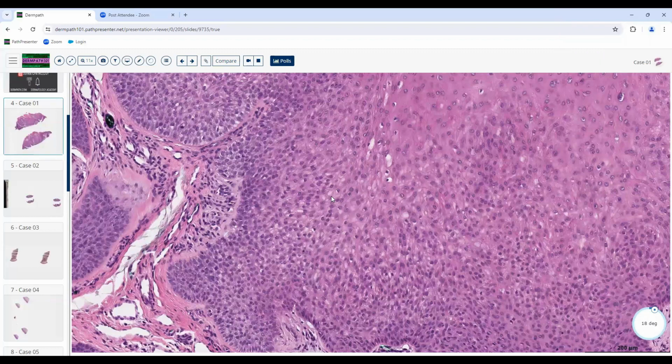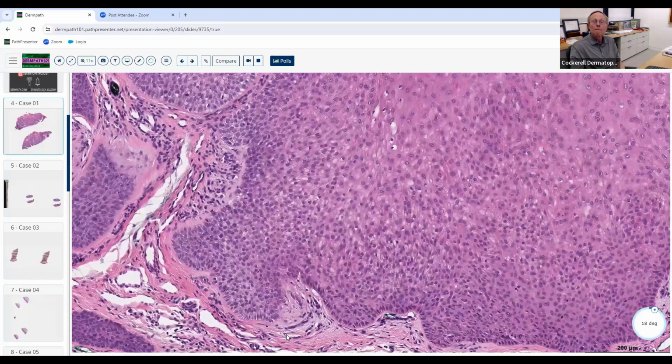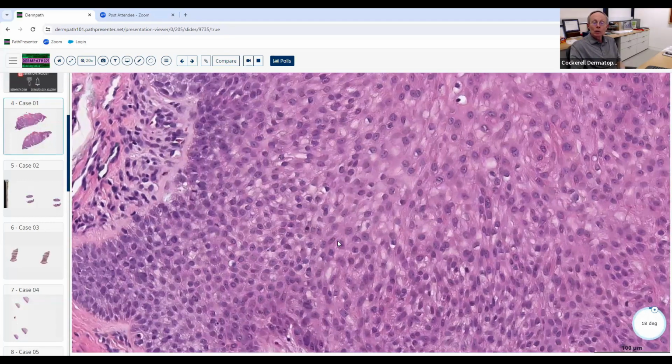Could it be, well, here I'm seeing the basement membrane. Yes, this is the basal membrane of the structure right over here. I agree with that. And this is recapitulating the hair papilla a little bit right here, little blood vessels. But there's something right in this field that's classic for outer root sheath differentiation. Is it the more clear cells? Yes, good. The more clear cells, like right here, and those clear cells contain glycogen in them.